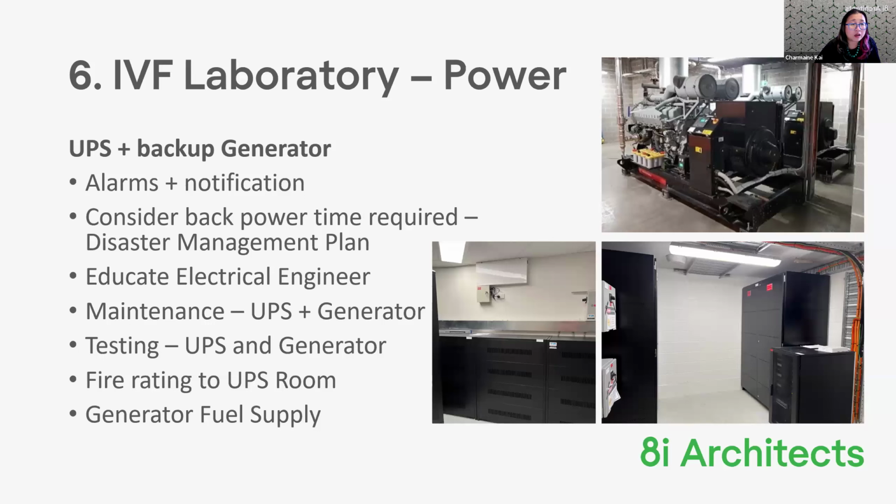So power, absolutely critical in an IVF lab. UPS and backup power. So UPS in an IVF lab, most of the equipment requires it simply because it takes out the peaks and dips of power where it's not as reliable, but also for backup. So really important.